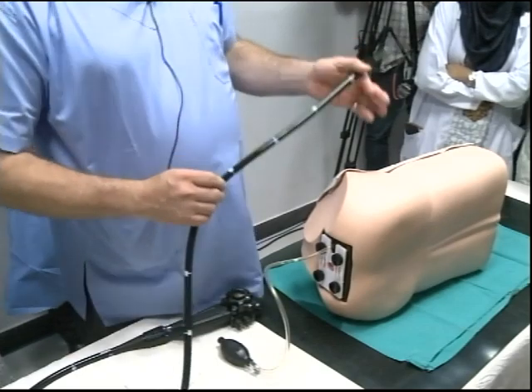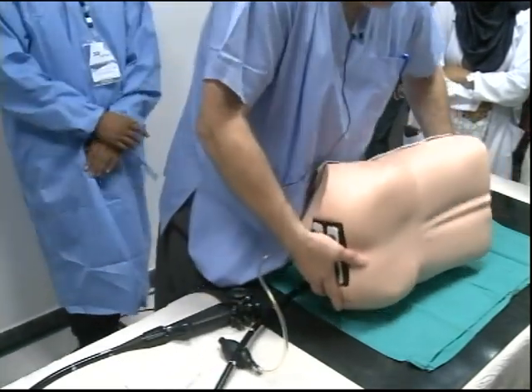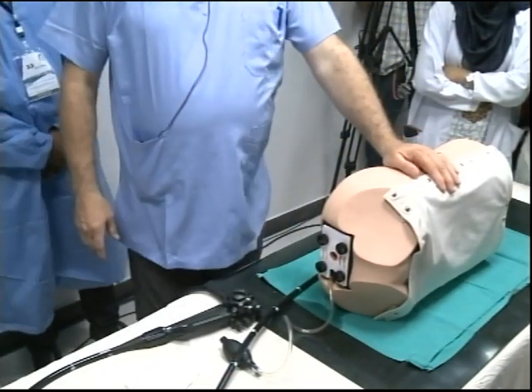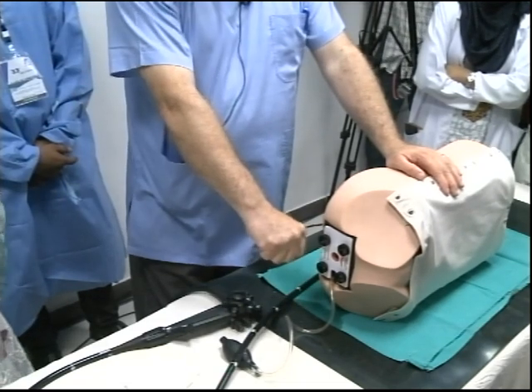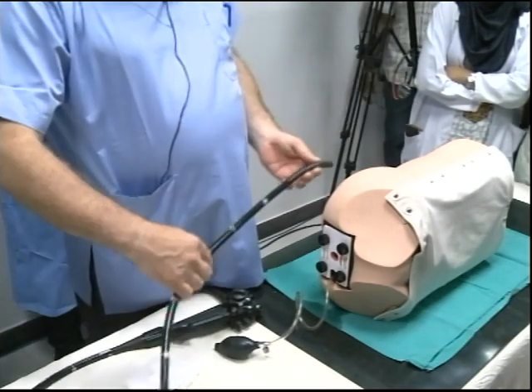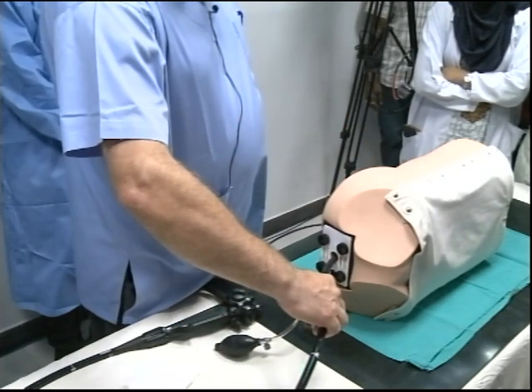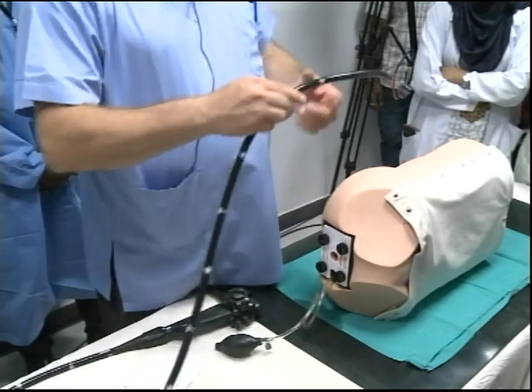If you were to put a rigid sigmoidoscope into this patient, which direction would you put it in? Would you put it in like this? No. Right. And the reason for that is that's the direction it's going. So why on earth does everybody else, when they scope, let the hands drift here and let the hands drift here? Right? So let's look at it.